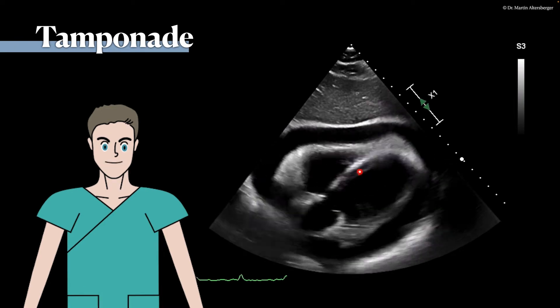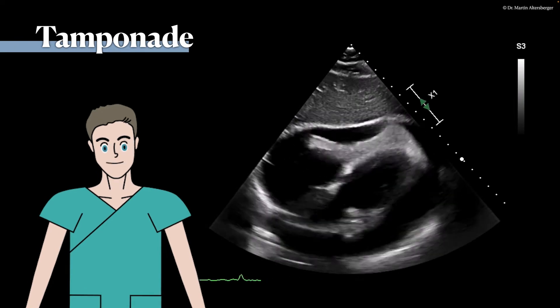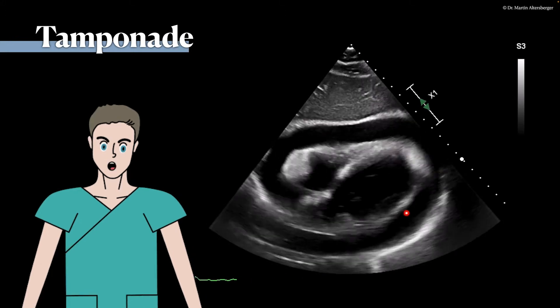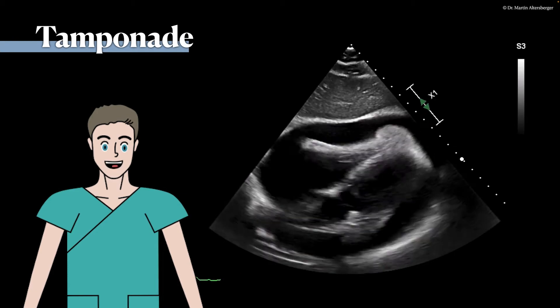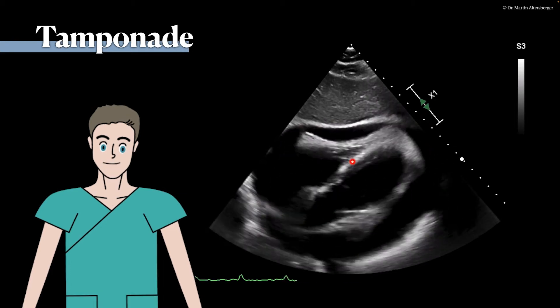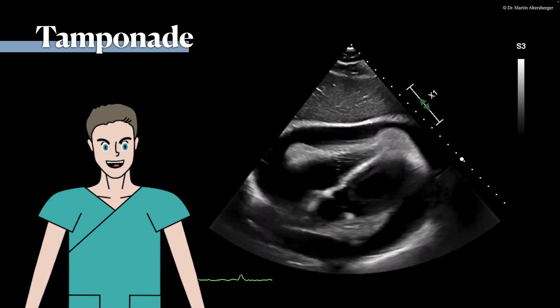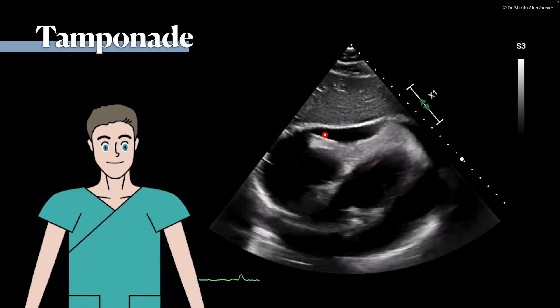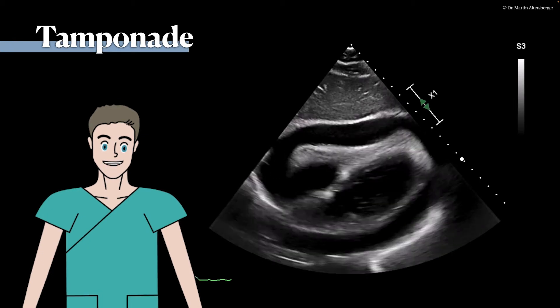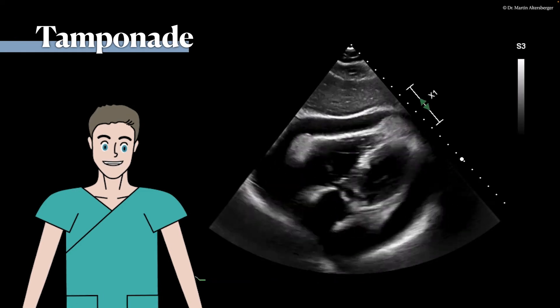Also take a look at the interventricular septum. There is a bouncing motion — so-called interventricular dependence — because there is so much fluid around the heart compressing the entire heart. When the right ventricle is filling, it tries to compress the left ventricle because there is simply not enough space in the pericardial space, which is filled with free fluid. This patient needs emergency treatment with pericardiocentesis.